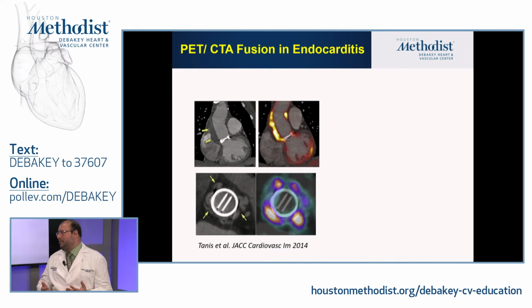Now you need something, a tiebreaker, to differentiate. Is this an infection that's going to send you to the OR for a high-risk redo, versus just treating with antibiotics for a pneumonia that has nothing to do with the infection? Right. And some infections may be devastating, as you see in here, where the entire graft and root is affected, and some of it may be just self-limiting.